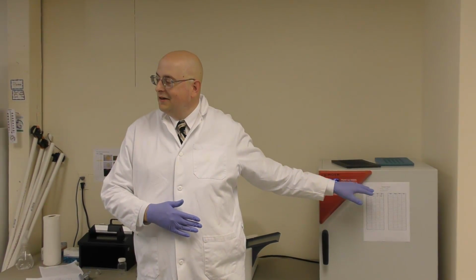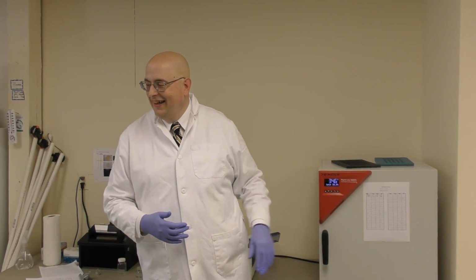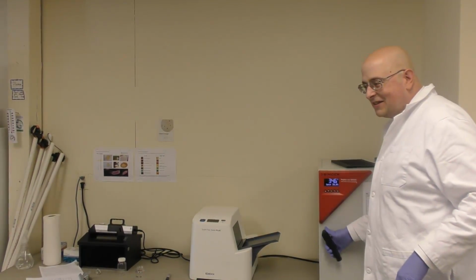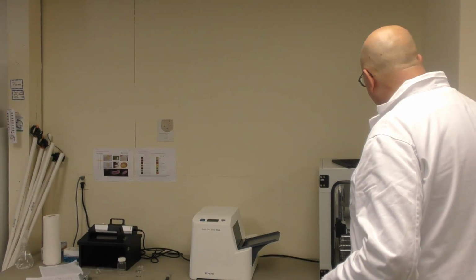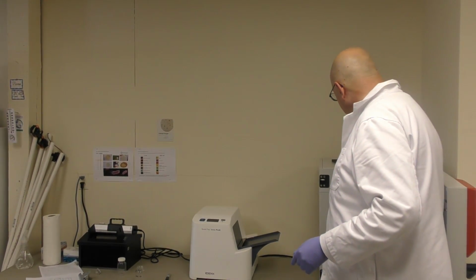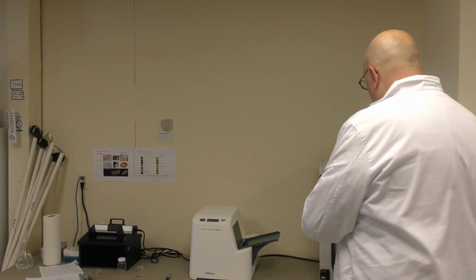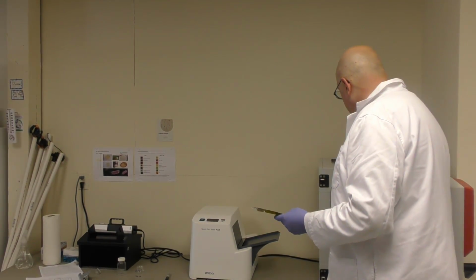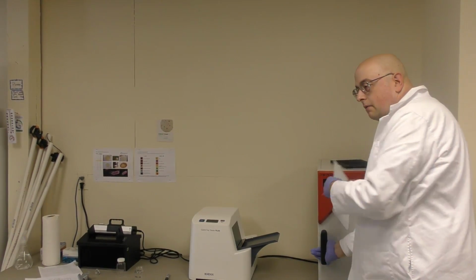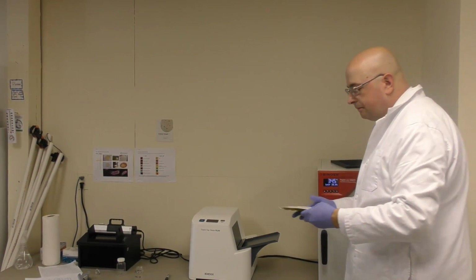Okay, so we're now 24 hours into the future. Just like a cooking show, I have prepared my turkey. Julia Child, I'm Julian Childs in this training video. So I came here yesterday and we processed a sample from the same site, so we're going to retrieve that. I've already recorded the temperature of the incubator before I pulled that sample out.